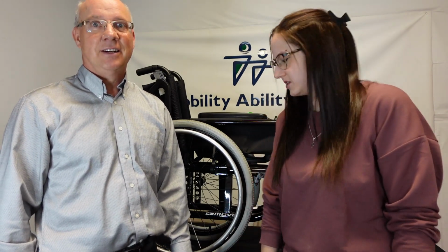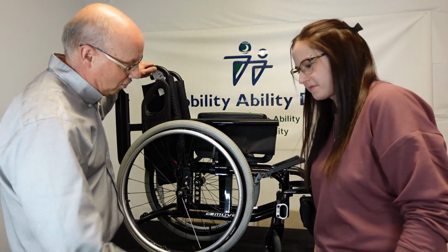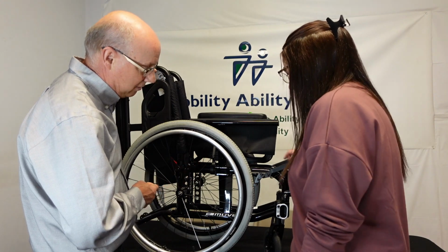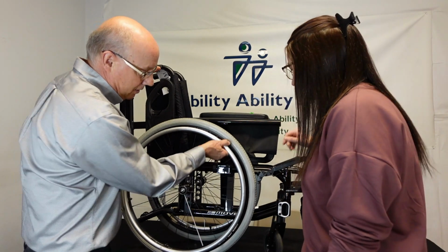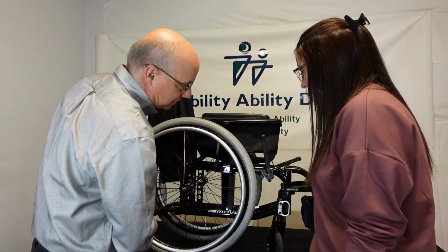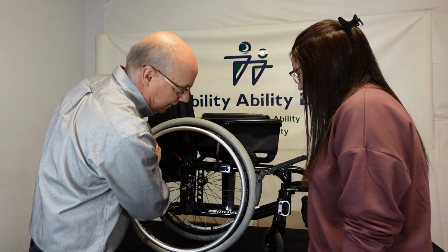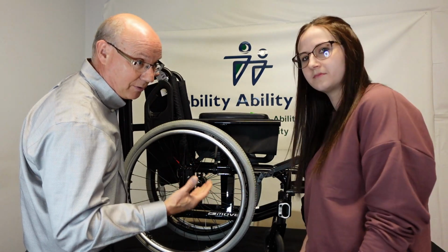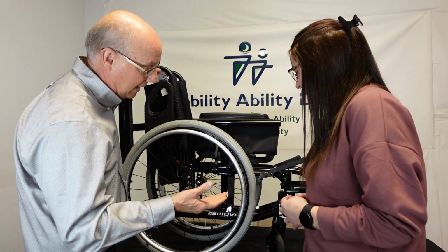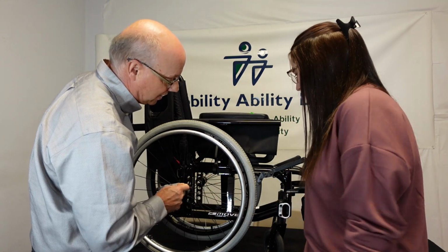Today we're going to show you how to adjust your brakes on a manual wheelchair. We've got a manual wheelchair here. What have you noticed? As you can see, right now there's no contact with the brake. This is the normal position, and then you want to lock it. The brake is not locking, so that's a safety concern. Because the brake's not holding, when the person puts the brakes on to get up, the chair will move and they could fall. So it's really important to adjust the brakes.